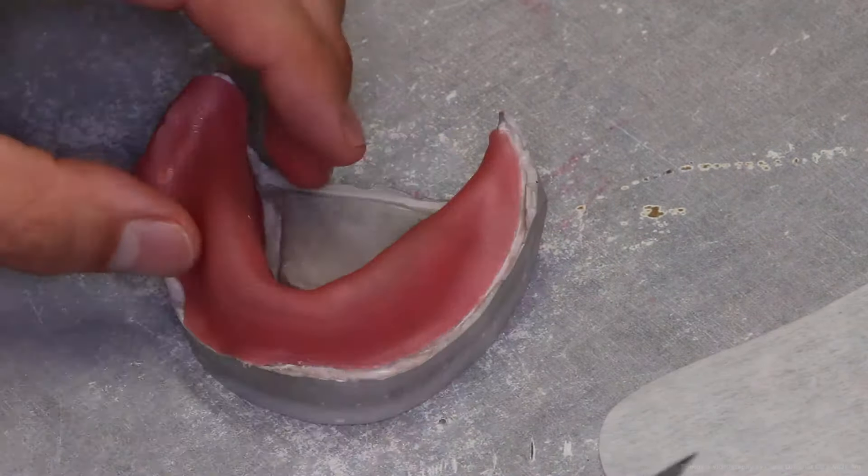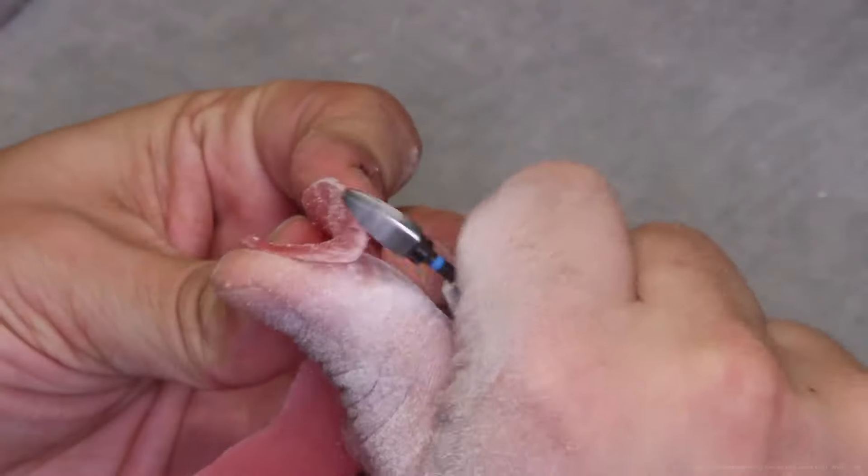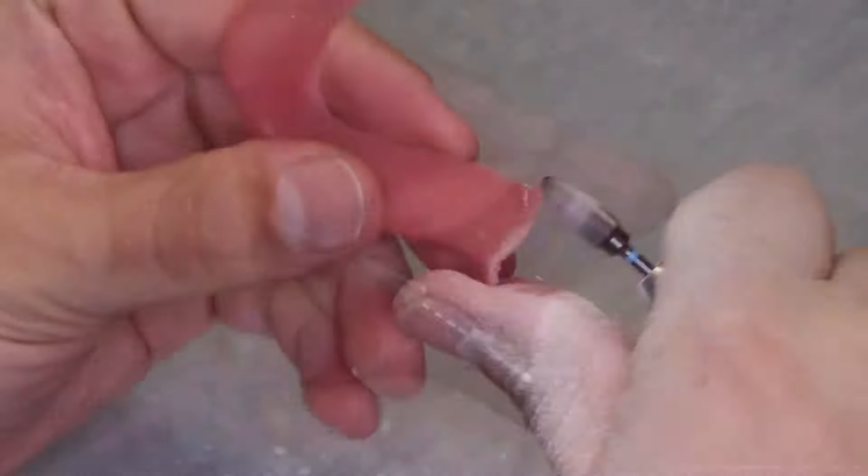Once the record bases are safely retrieved from the models, they can be placed back into the light curing unit with the intaglio surface facing up to ensure the material is fully cured. Once fully cured, you can begin smoothing the borders. Check for sharpness with your fingers — if it feels rough or sharp to your finger, it will feel even sharper intra-orally to the patient.